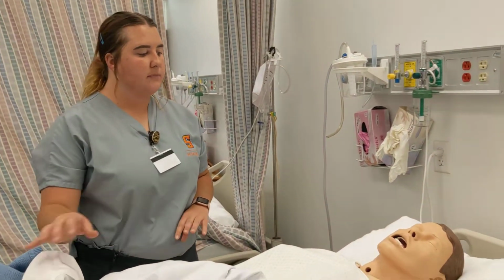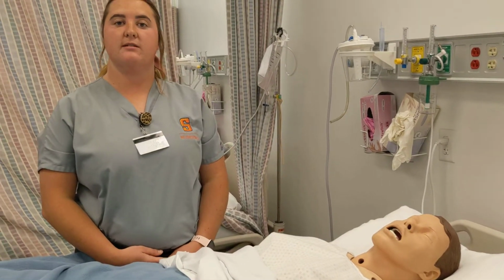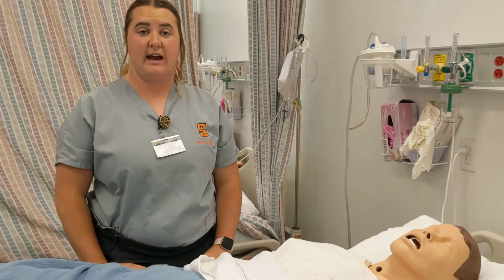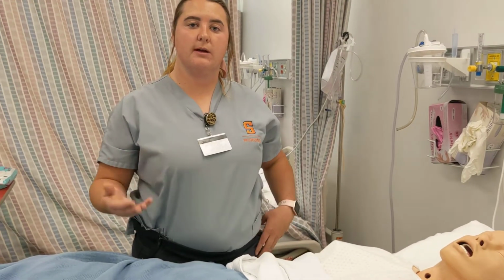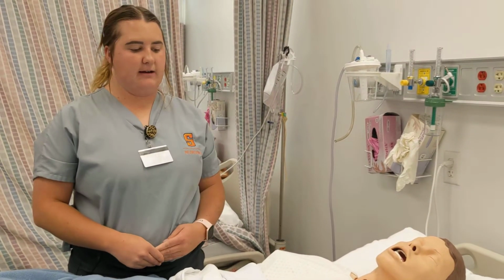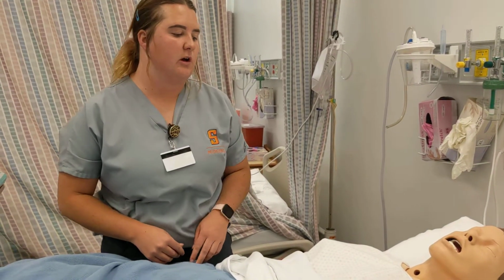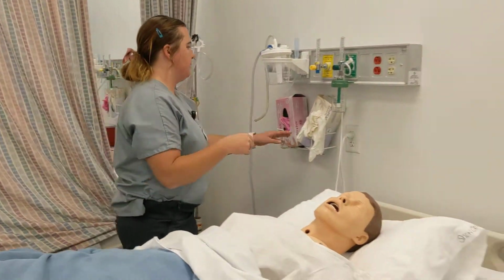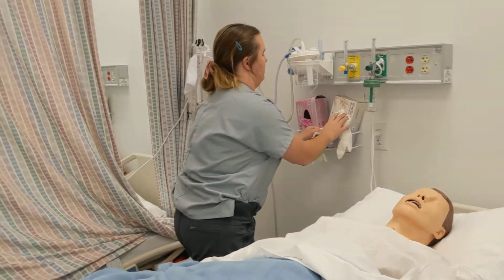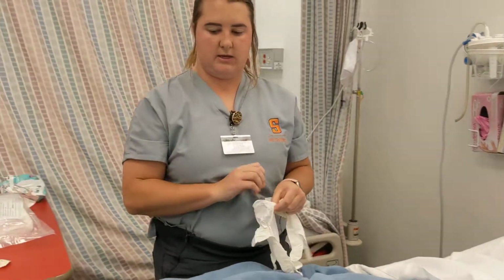And yeah, so I would go through with the patient, let them know why we are doing this catheter, what this catheter is. That might be a little bit uncomfortable, but we're gonna help them get through it. We'll breathe together and answer any questions they have. Just make sure they're very informed. So now that the patient is down, they said they're comfortable how they're laying. I'm just gonna put gloves on, and we're just gonna start and clean the patient.